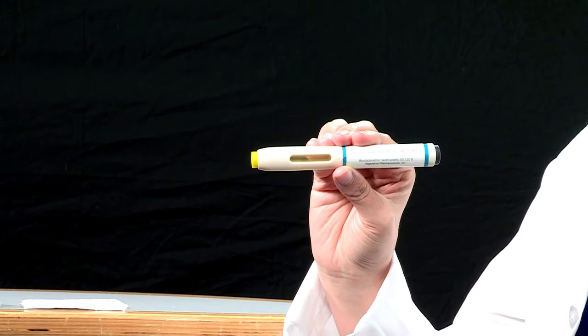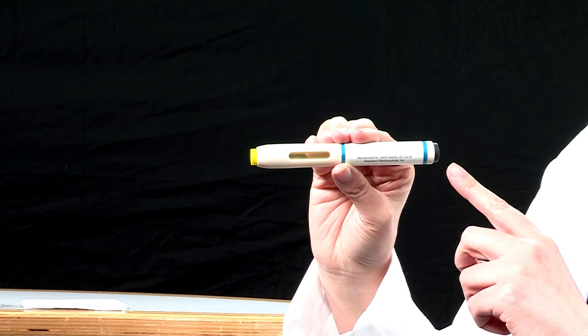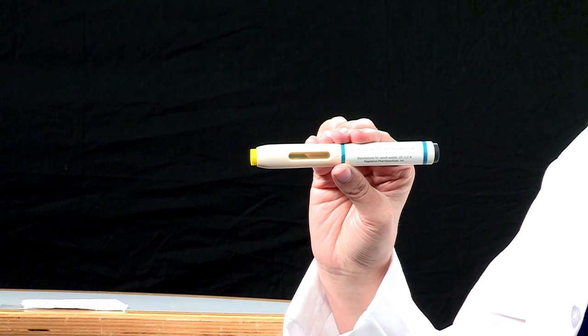Your autoinjector will either have a green or gray activation button. This one has the gray colored button. Don't touch it until you're ready to inject the medication.